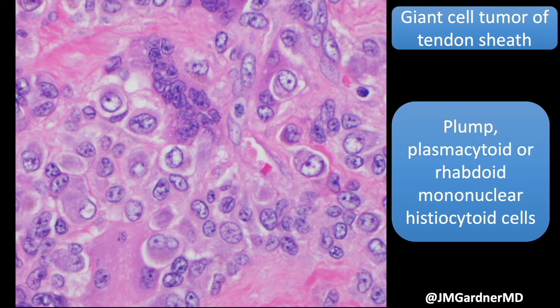Here's a closer look at those cells. They are plasmacytoid — or I kind of think of them almost as rhabdoid; plasmacytoid is probably a more apt term — but I lump those two terms together. Recognize that those are the lesional cells you want to find in a giant cell tumor of tendon sheath. Mitoses are usually present and can sometimes be quite abundant — many mitotic figures — and they can look really quite scary when you see cases like that.